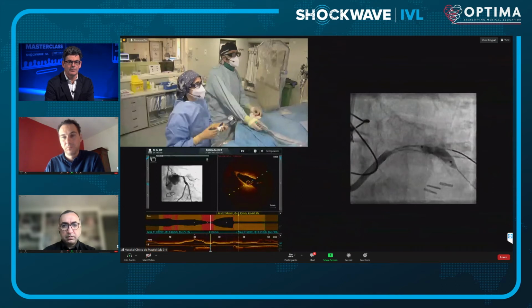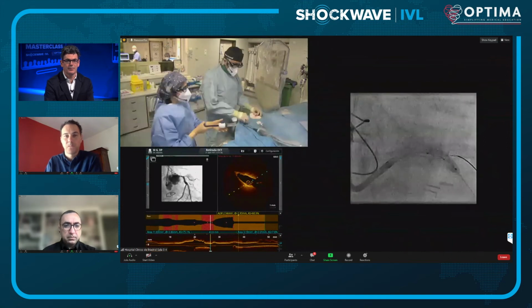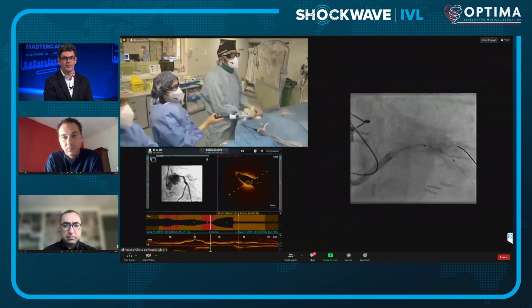Did you see the bubbles there? Clear. Yeah, we see them. How many shocks are you up to now? Well, I think we have now performed, we are going to stop. We give 60 more here. Yeah, so we have 20 left, but I think that probably at this point we can stop.